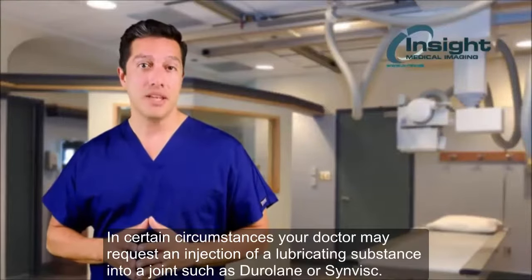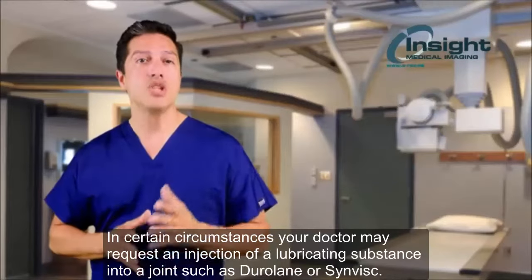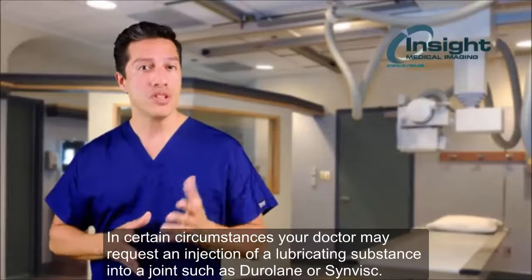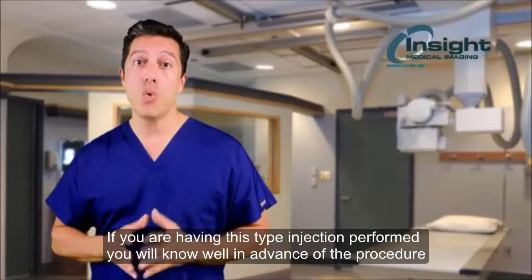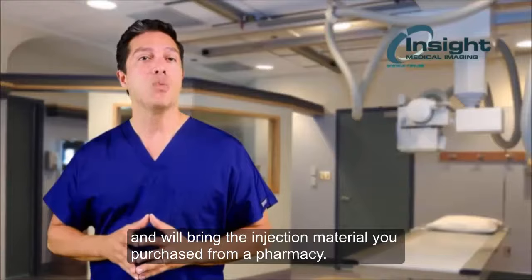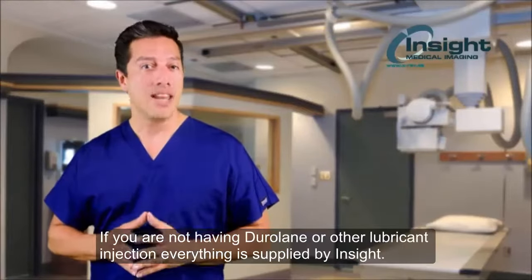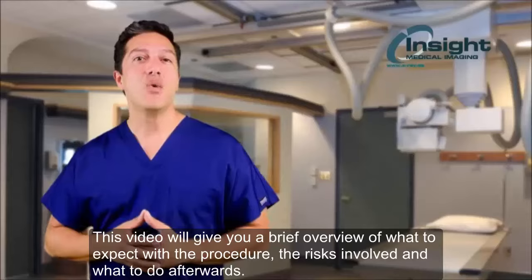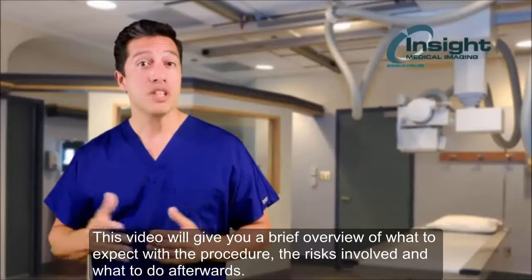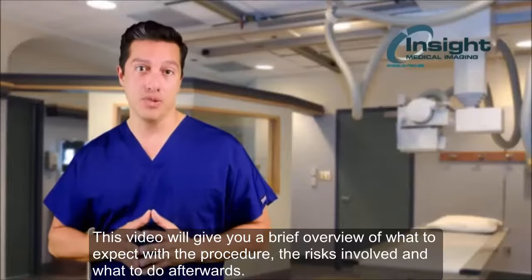In certain circumstances, your doctor may request an injection of a lubricating substance into a joint such as Durolane or Synvisc. If you're having this type of injection performed, you will know well in advance of the procedure and will bring the injection material you purchased from a pharmacy. If you're not having Durolane or other lubricant injection, everything is supplied by Insight. This video will give you a brief overview of what to expect with the procedure, the risks involved, and what to do afterwards.